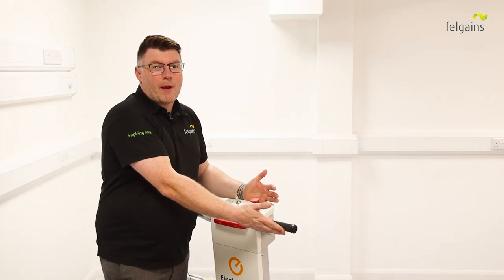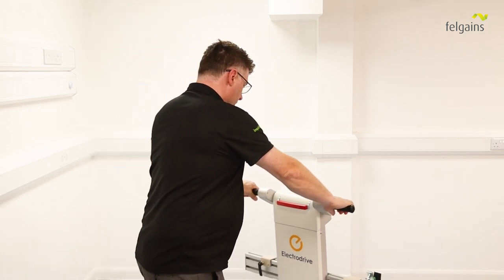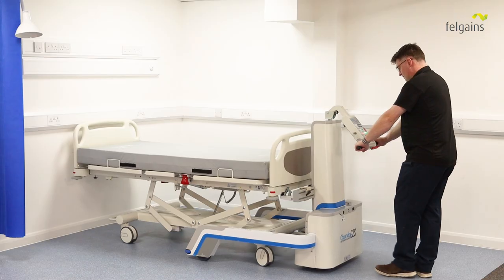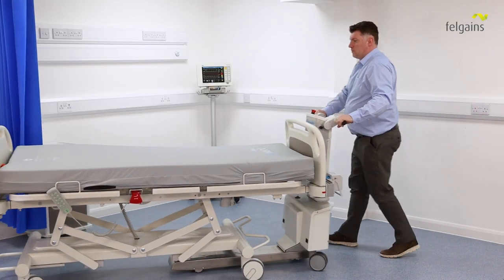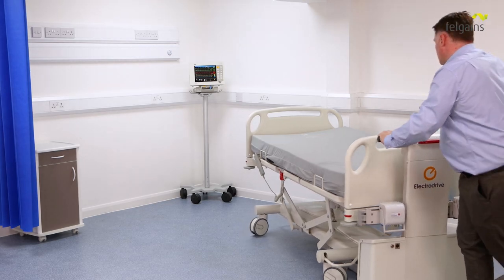The right hand grip acts as your throttle. Simply rotate it away from you to go forward and back towards you to go back. Using a Felgainz bed mover is very similar to pushing a bed or stretcher, just without the manual effort. You can now push, pull and turn the bed with ease.